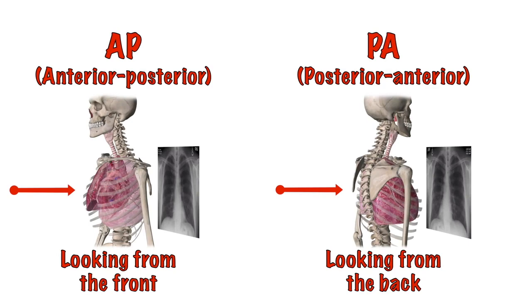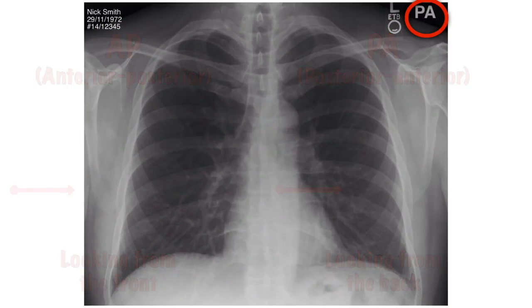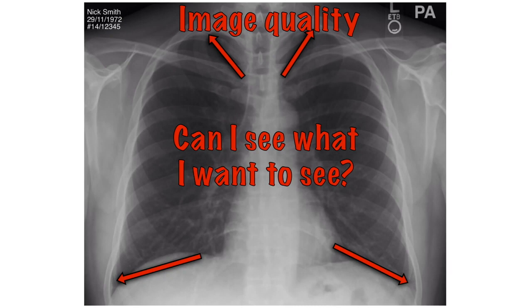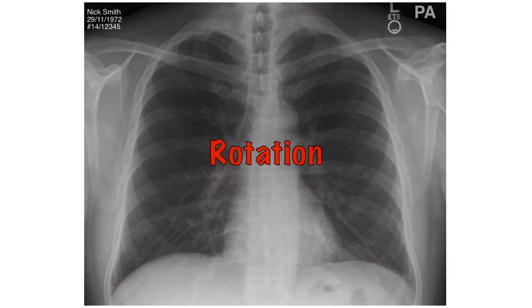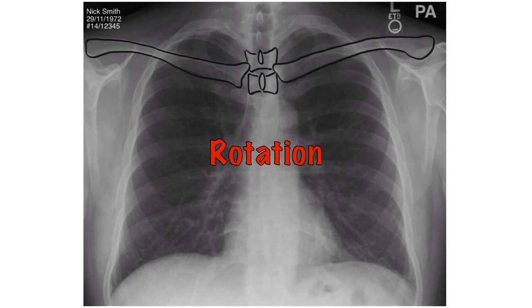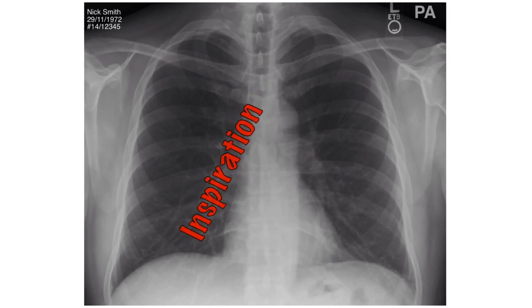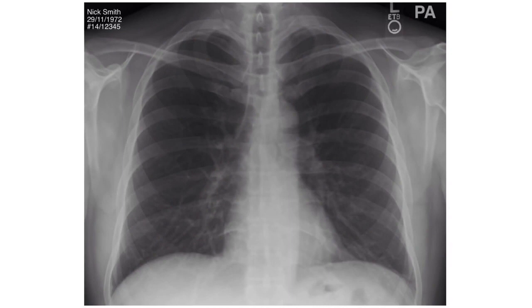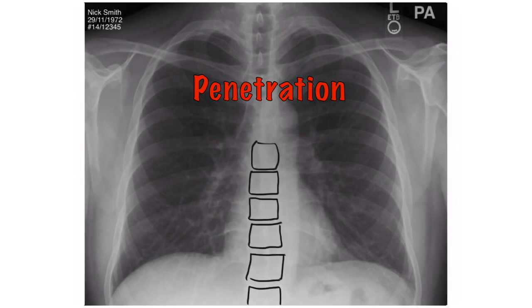The orientation of the film — is it PA or AP? Often useful information may be written on the image. In terms of image quality, ask yourself if you can see everything you need in the picture, then check three aspects using the mnemonic RIP: R is rotation — the spinous process should be at the midpoint between the medial ends of the clavicles; I is inspiration — five to seven ribs should be visible anteriorly; P is penetration — is the spine visible behind the heart?